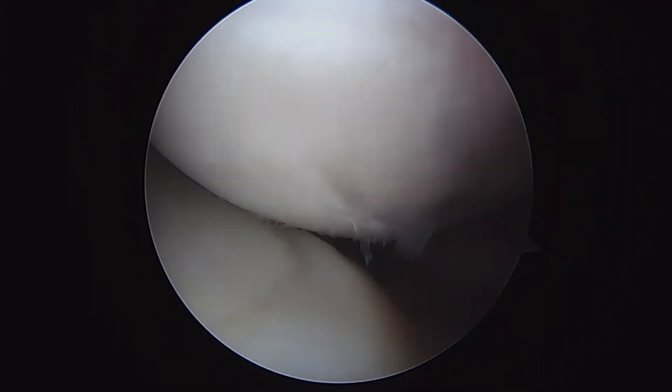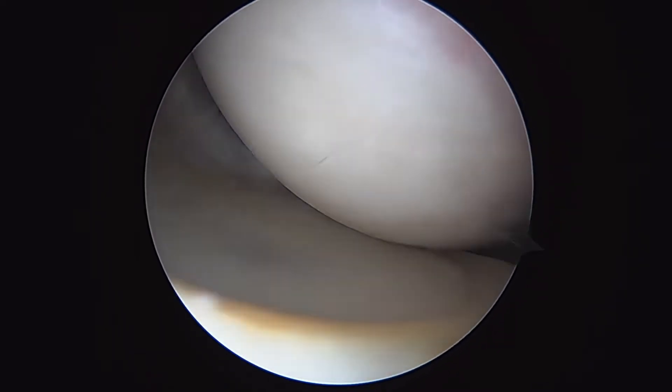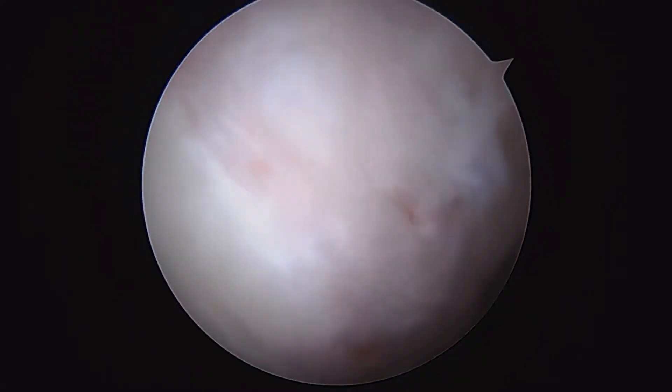We're in this patient's shoulder — a right shoulder, 47-year-old lady. Here's the glenohumeral joint, so humeral head above us, glenoid below. Looking down, that's the inferior glenohumeral ligament.